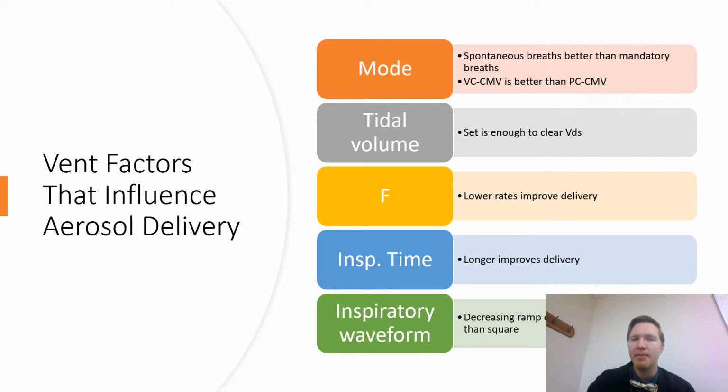So let's talk about the ventilator factors. So vent factors that influence aerosol delivery. One of the first ones that we'll talk about here is the mode. What mode is my patient in, right? If they're doing spontaneous breaths, they're considered to be better than mandatory breaths.